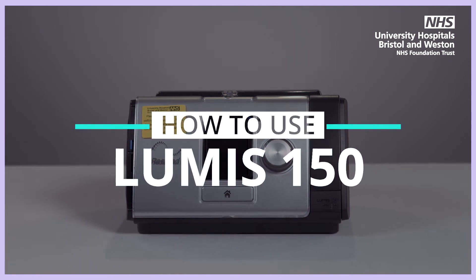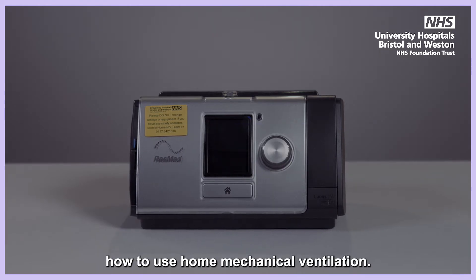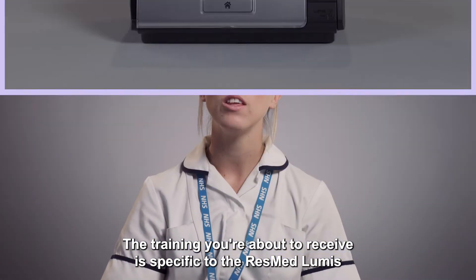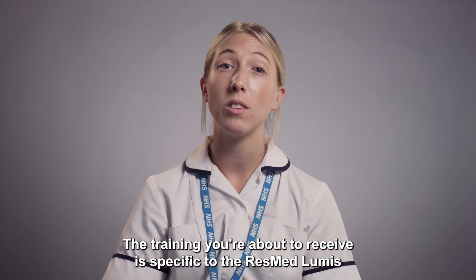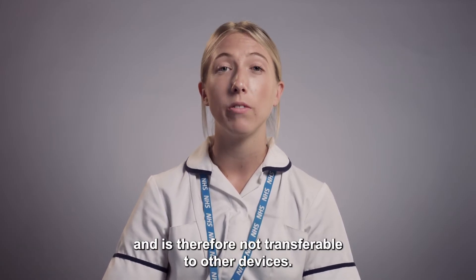Lumis 150. This video provides training on how to use home mechanical ventilation. The training you are about to receive is specific to the ResMed Lumis and is therefore not transferable to other devices.